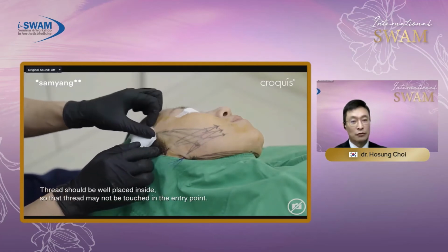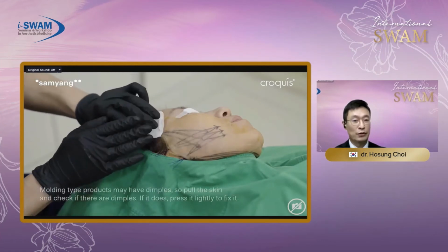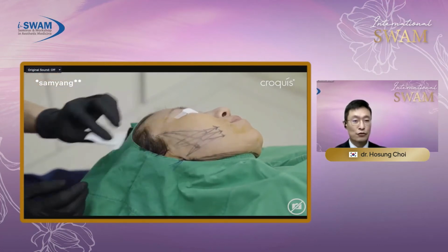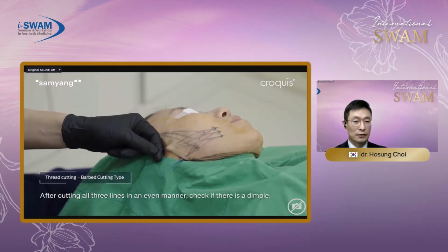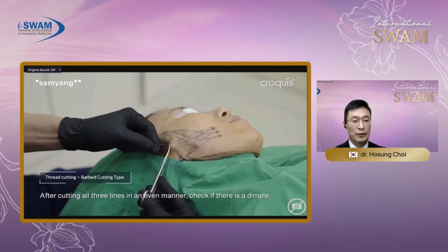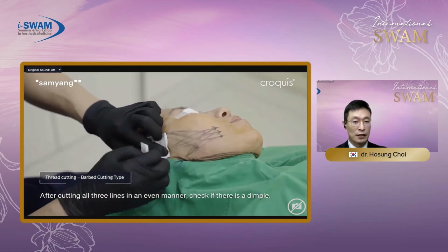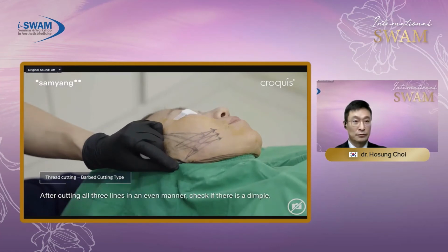Even though there may be some skin dimples at the entry point, it is easily resolved by pulling the skin. And while pulling the skin, check the whole pathway of the thread. Minor dimples, minor folds are not a big deal. They will be spontaneously resolved. But if there's a severe dimple or fold of the skin, it's better to release them before finishing the procedure.